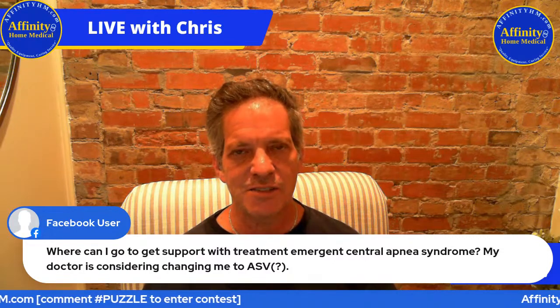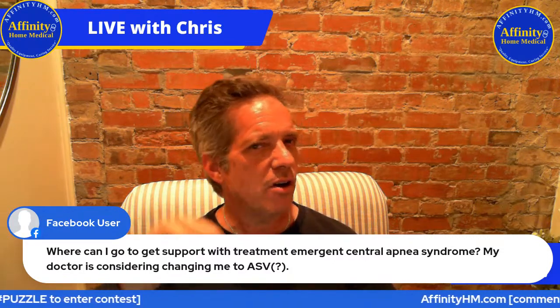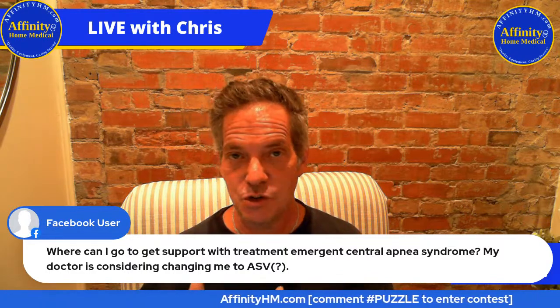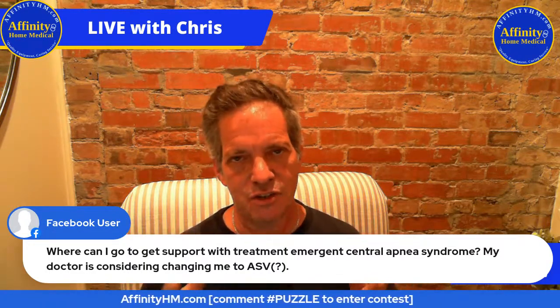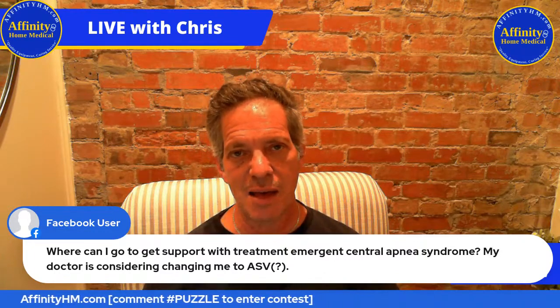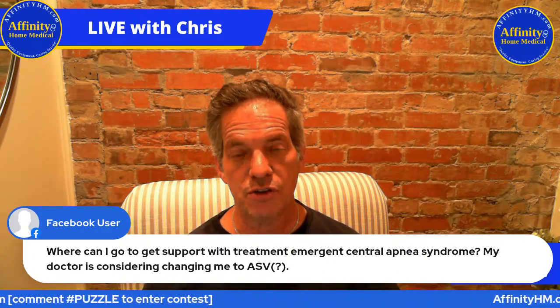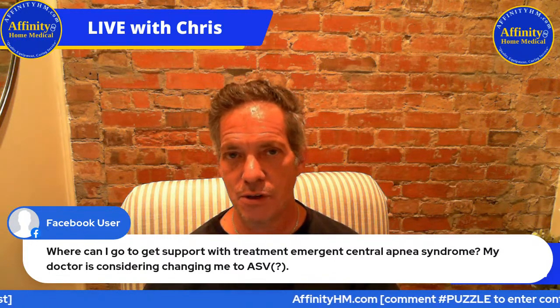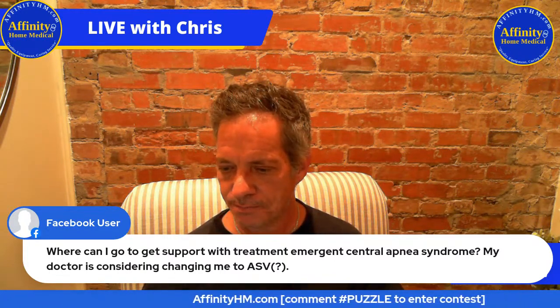Whenever one needs an ASV, you probably have what I talked about very in the beginning of the video: obstructive sleep apnea versus central sleep apnea and mixed. So you probably have mixed sleep apnea, and really talk to your doctor. Even some of the staff around the doctor may have the answer for you. All right. So I hope you find that answer.